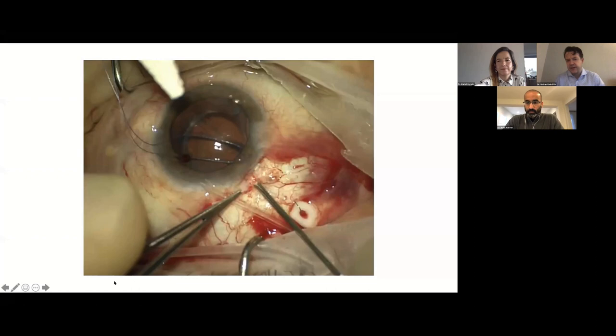I liked what you were doing there, going back and forth, because the reality of entering the eye with a needle is that it's not a guarantee that the tube is going to follow the same pathway. And I can't tell you how many times my needle has gone in the anterior chamber and then my tube comes through the sulcus, or vice versa. And keep in mind, we operate on a lot of eyes with PAS, and there is no ideal place to enter the angle because there's no angle. It's all iris. And so in some cases, in order to protect the cornea, you're going to have to come in right where the iris is adherent, and you're going to have to go back and forth and create the pathway. And that's where injecting viscoelastic as you come in can push the iris back, and then sawing back and forth, basically saying, hey, in a minute when the tube comes through here, I'm making a pathway, can be just so helpful. And you want to do that rather than put a tube too close to the cornea, because that's the critical thing. And so I liked what you did there.